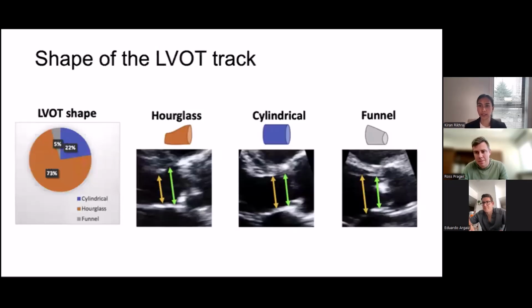Yeah. Totally agree with that. And I think it also goes back to our point of, why do we just use the VTI? Why do we ignore that LVOT diameter, right? If you're measuring it consistently, your LVOT VTI should be reliable and you should be able to measure the changes in that. And that should really influence your decisions more so than pi r squaring a false number. That's right.